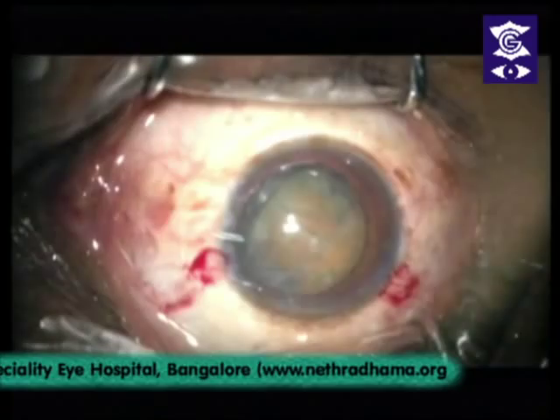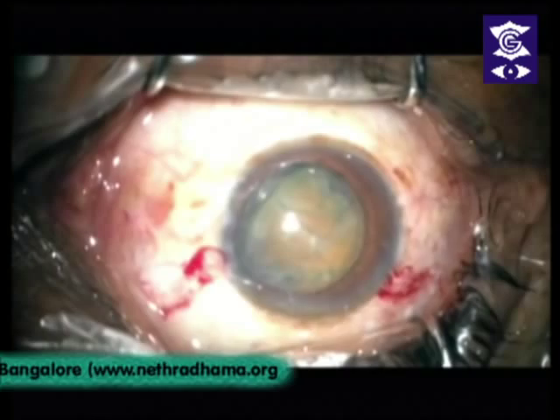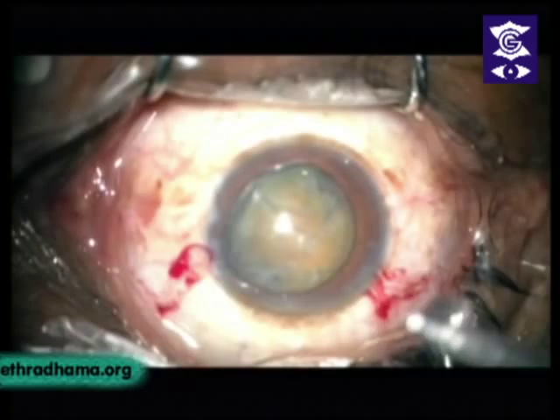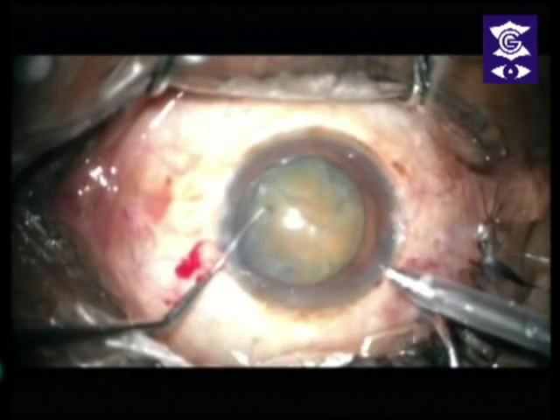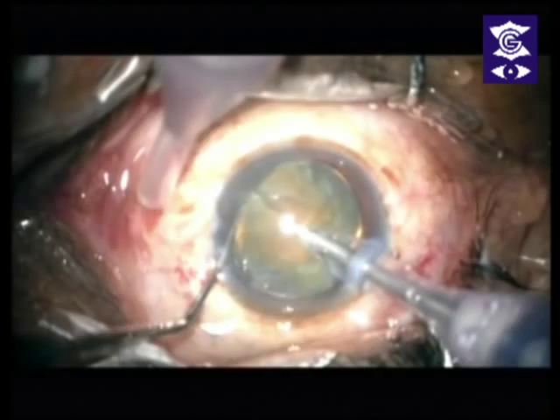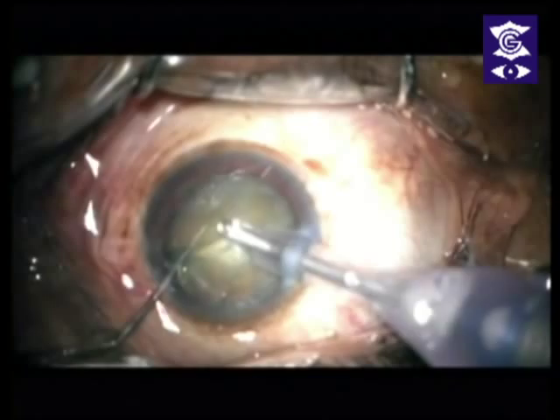Let's go to the phaco. We'll be using about 325 vacuum. I use continuous bursts like this and get it in there, then go from the side and simply approximate the chopper and phaco tip. And you get one chop. Once you get one chop, the rest of the cataract will obey you.